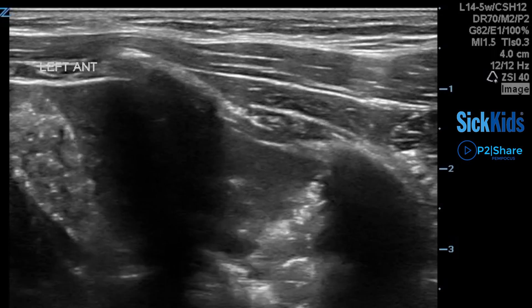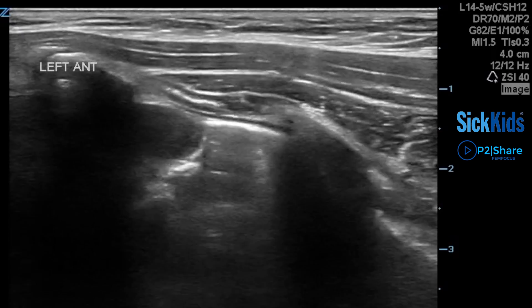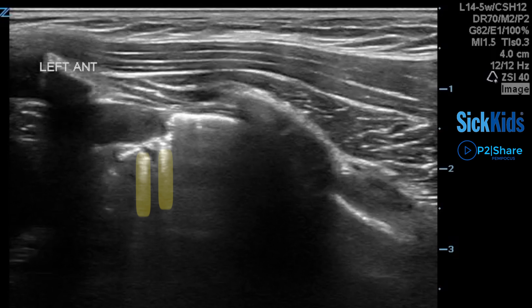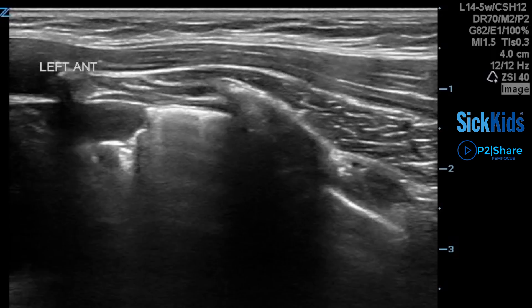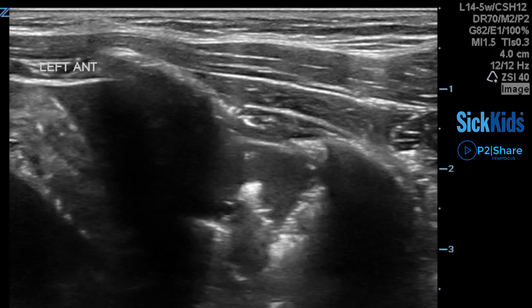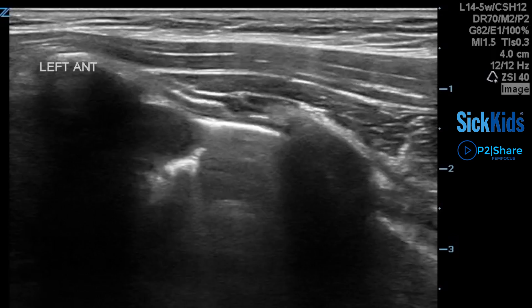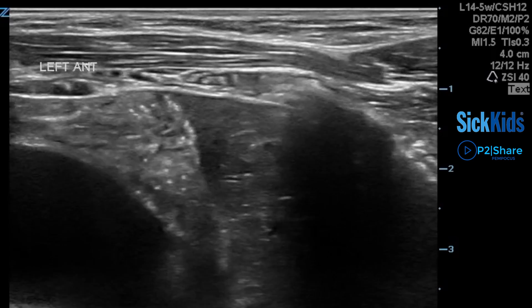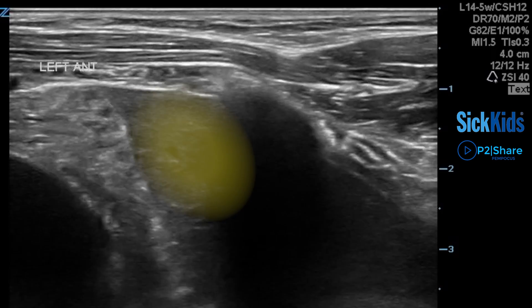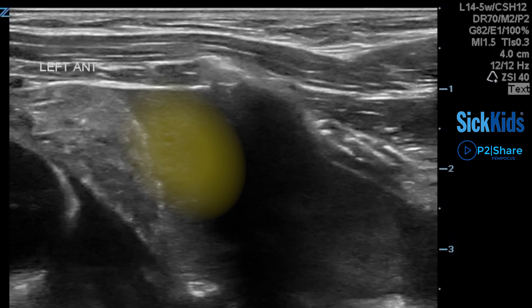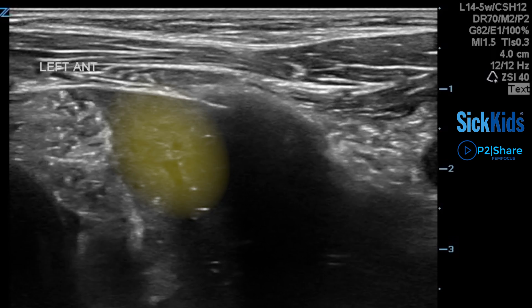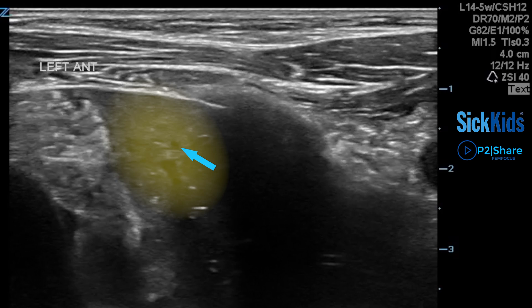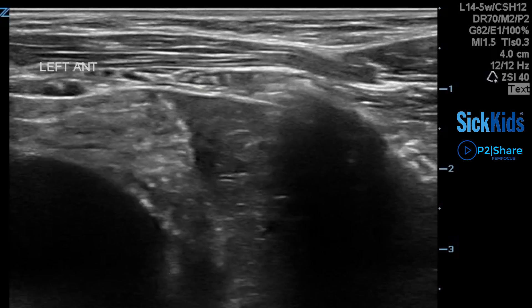Whereas with a consolidation in this case, you can see some of those things quite clearly. As the clip runs through towards the end, you'll see confluent B lines behind the consolidation, which is sitting above the thymus. You can also see other features of a consolidation, including air bronchograms and fluid bronchograms, which are quite prominent here — visible just underneath the rib shadow.